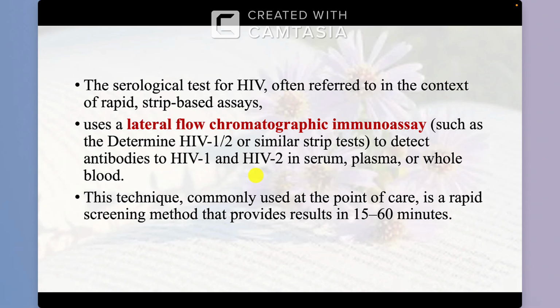The principle here uses a lateral flow chromatographic immunoassay to determine HIV-1 and HIV-2, similar to the strip test, and the result will appear between 15 to 60 minutes.